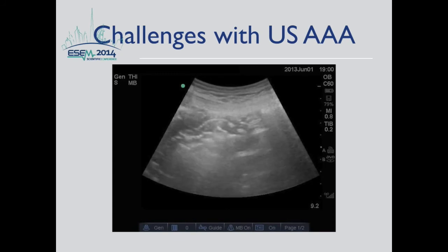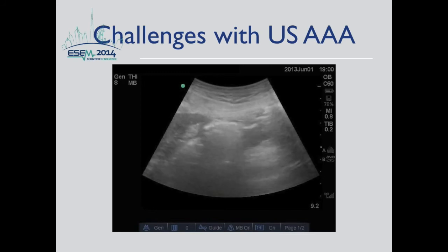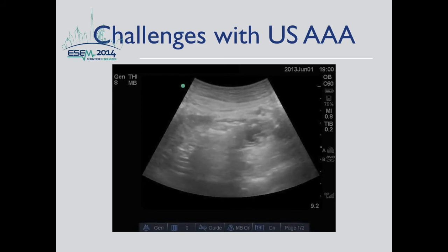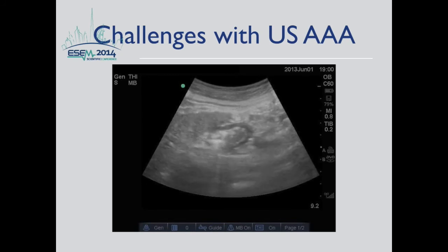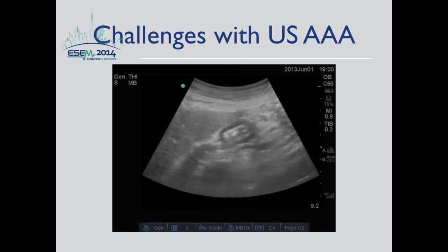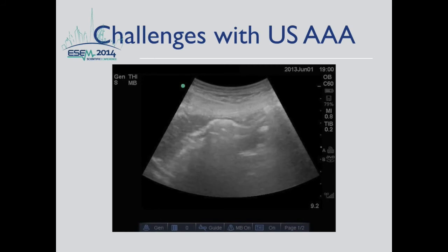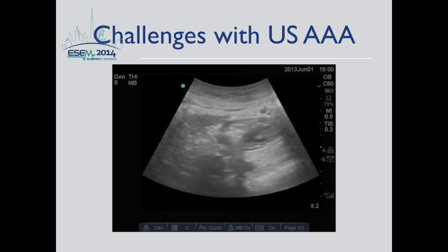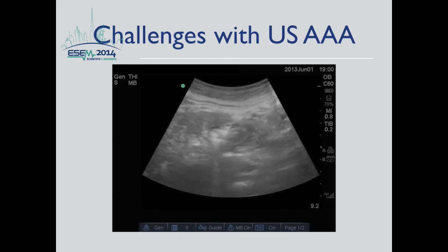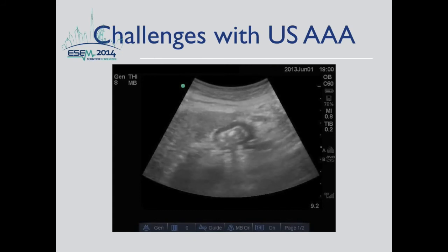If the bowel is encountered, apply steady pressure by pushing towards the patient's back with the probe. The bowel may be effectively compressed or undergo peristalsis. You may also try to jiggle the probe to move the bowel aside. Another alternative is to fan through the window between the loops of bowel. This is accomplished by establishing a good sonographic window just cephalad to the area obscured by the bowel and tilting the probe towards the feet. Similarly, find a window just caudad to the obstructed area and angle the probe towards the head.